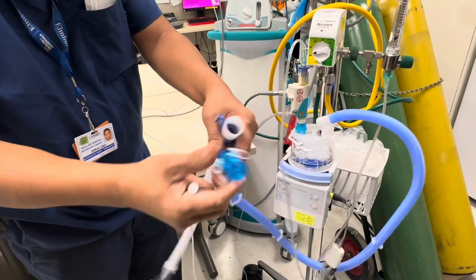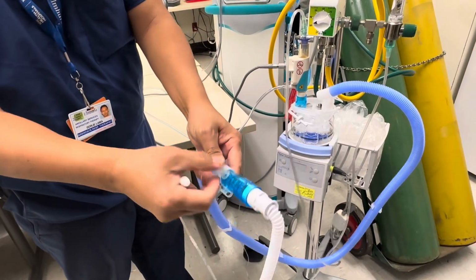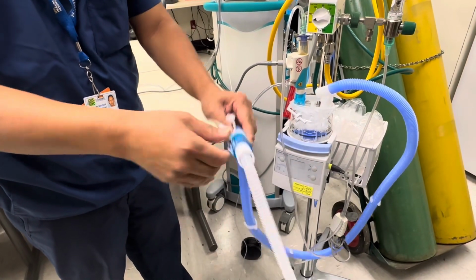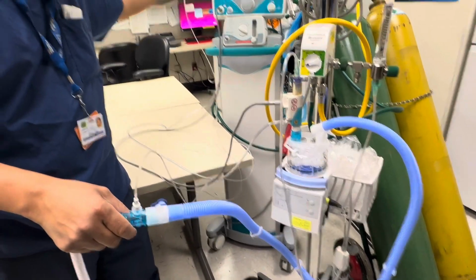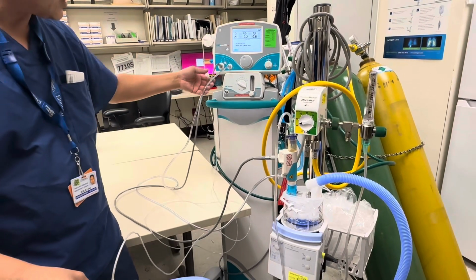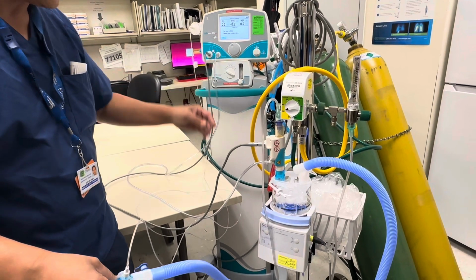Okay. All right. So then the other port goes directly to here. And the little port here is where we're gonna put the sample line. Okay, the sample line right here. So the sample line obviously goes over here. You know, right? It goes right here. You see it? Goes over here. And then there's 2 connectors for the nitric oxide for the injector, and the tube here goes right here.